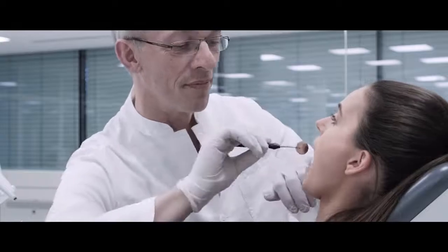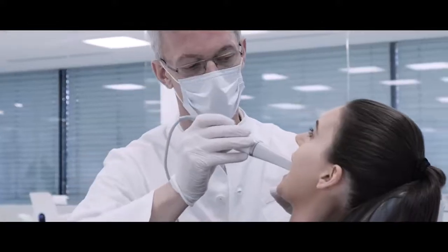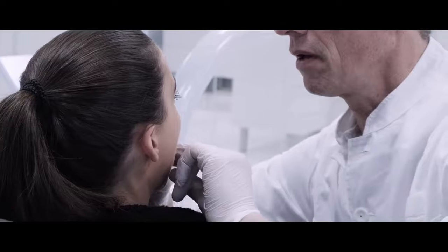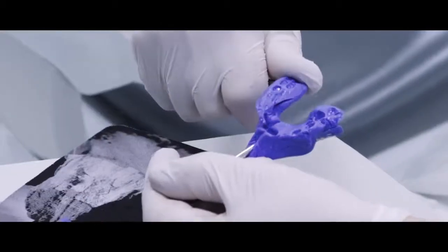Working with Zirkonzahn's digital workflow, the dentist starts with the analysis of the patient and the acquisition of impressions by intraoral scanner. Following the recording protocol, the doctor digitizes the two arches. Together with intraoral scans, he also registers a fork necessary for the acquisition of mandibular movements.